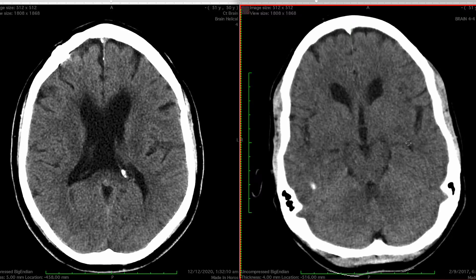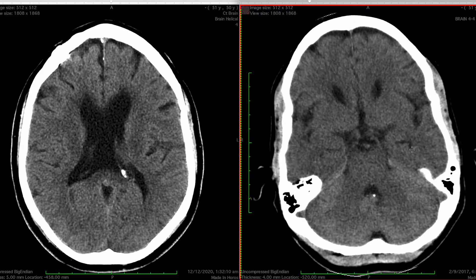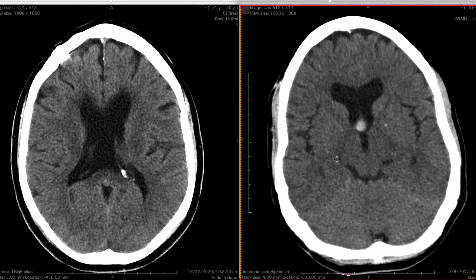We can also say that there is no evidence of transependymal edema, because the periventricular space right next to the ventricles is not low density.